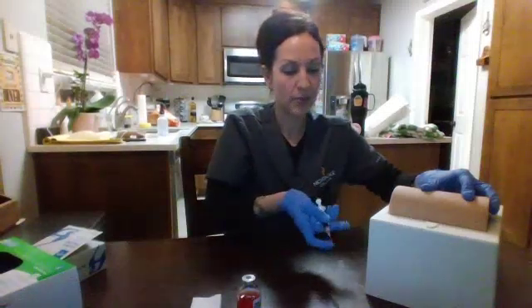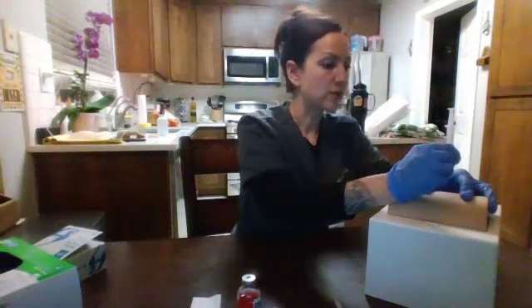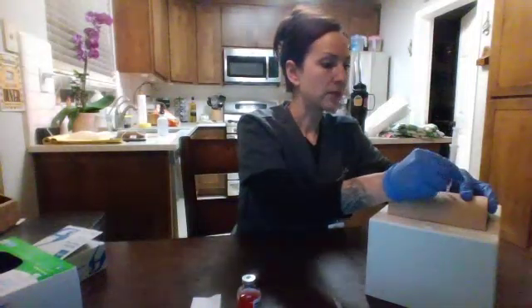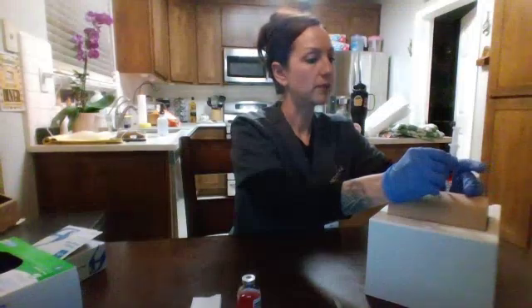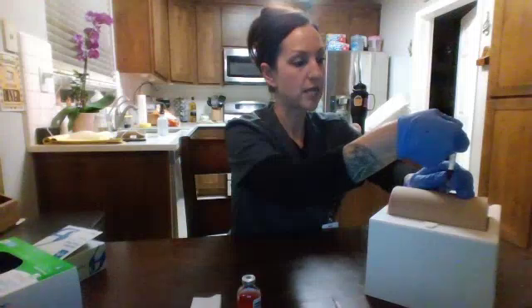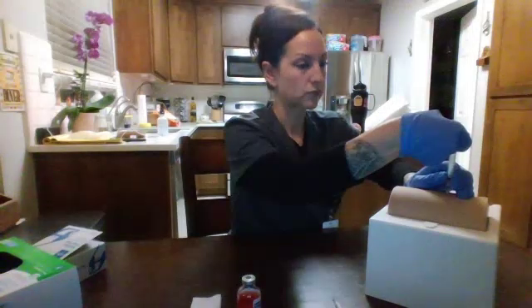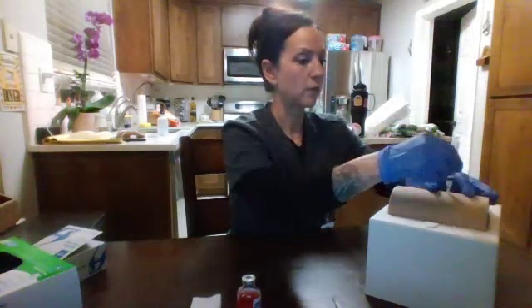So I'm going to remove the cap, and at a 45 to 90 degree angle, I'm going to firmly insert the needle. I'm going to, with my non-dominant hand, grasp the lower end of the barrel, keeping it stable, and with my dominant hand, inject the medication slowly over a period of 30 seconds into the patient. Okay, withdraw the needle and discard in the sharps container.